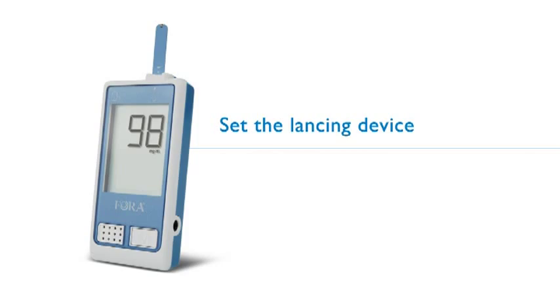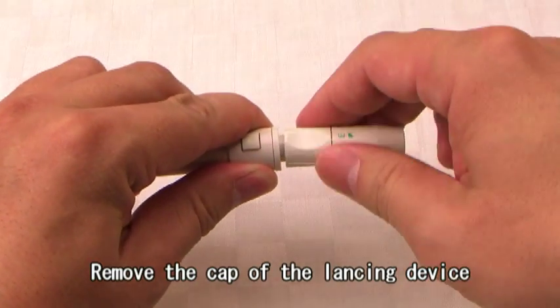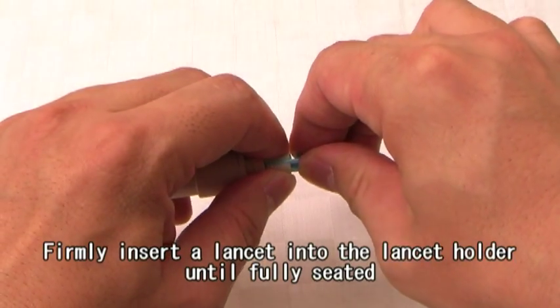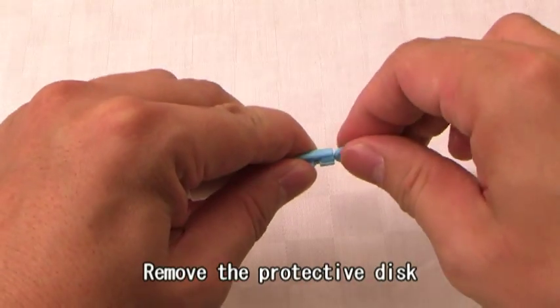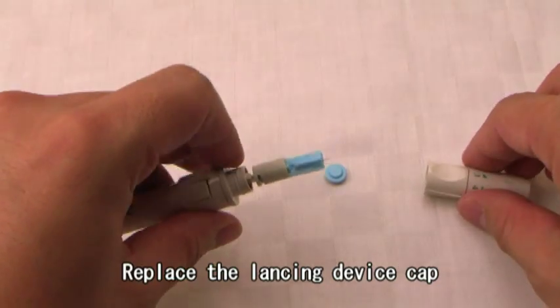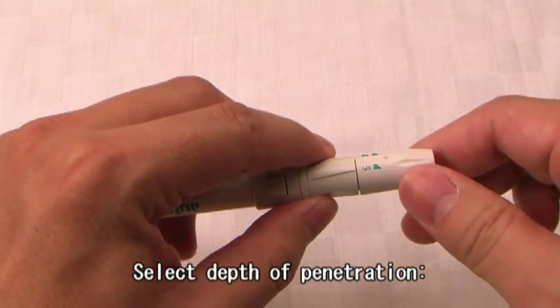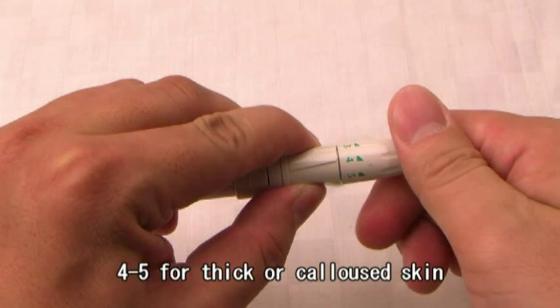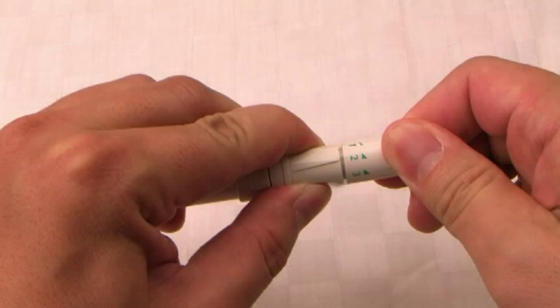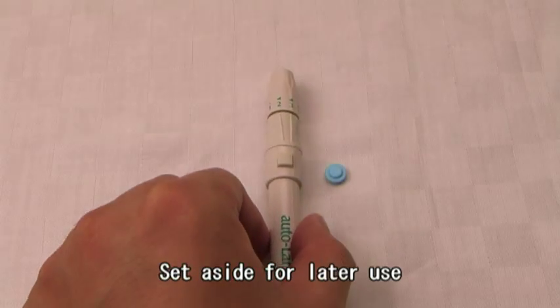Set the Lancing Device. Remove the cap of the lancing device. Firmly insert a lancet into the lancet holder until fully seated. Remove the protective disc. Replace the lancing device cap. Select depth of penetration: 4-5 for thick or callous skin, 3 for average skin, 1-2 for soft or thin skin. Slide the ejection control back until it clicks. Set aside for later use.